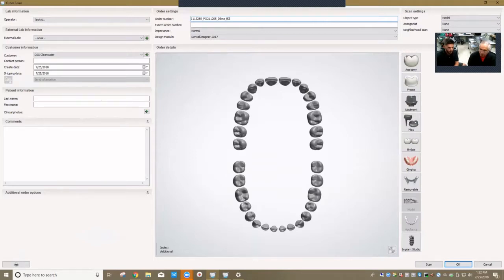Nobel. So this is what the PO sheet will look like. Put the pan number, what company it's going to, and then your PO is located in the top right corner. And this goes in the pan. And when the abutment comes in from the manufacturer, it'll be stapled to the packing slip and put into the PO inbox.